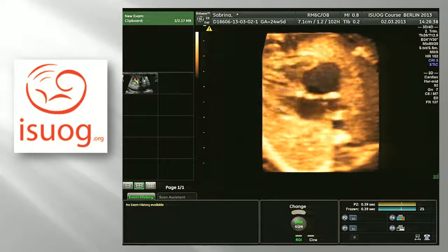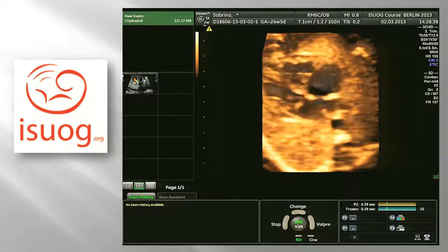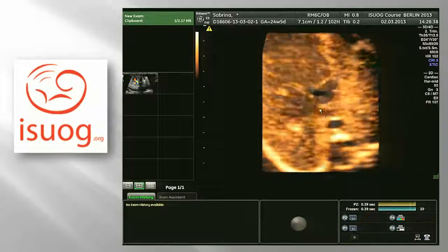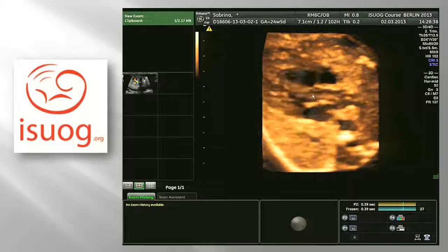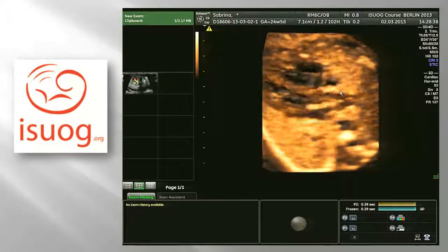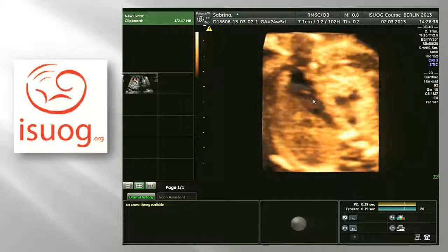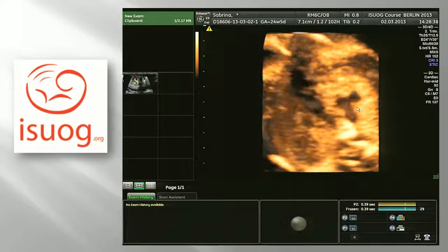I have a very nice one. But you see now the aorta on the right side, and then you see the right ventricle, the left ventricle, both atria, and when I do again the virtual examination, you see the course of the aorta coming from the left going to the right. You see the pulmonary trunk, and you see the aorta staying on the right, and you have an impression of the diameter of these vessels.